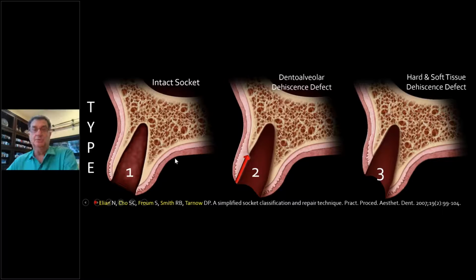The type 2 is where the buccal plate is partly gone, more than 5 millimeters away from the free gingival margin, and you only have soft tissue as part of the buccal plate, similar to many of those difficult cases that Dr. Elaskary showed you. And type 3, very few people get into trouble here with immediates because there's recession on the tooth before you start. The bone and the soft tissue are missing. In the limited time we have today, I'm going to go through each one of these to different degrees and give you an overview of where we are.